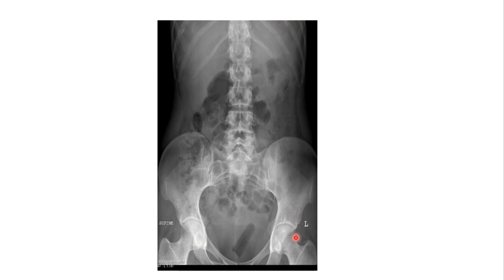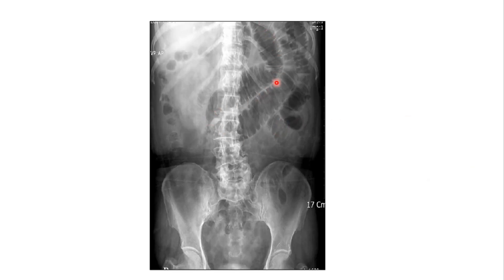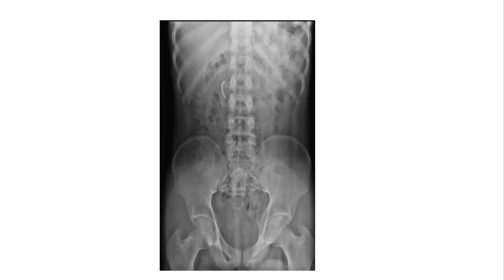Here is another plain AP view of the abdomen showing a case of intestinal obstruction, where you can see the step ladder pattern gas shadow in the intestine. The ribs, vertebrae, sacrum, pubic bone, and femur are also visible. The last example is a normal plain AP view of the abdomen with scattered gas shadows. No diaphragm is visible here, but there is a radio-opaque structure visible, which is likely an artifact.